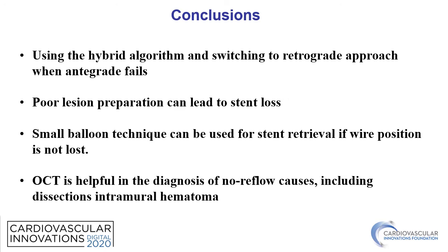Number two is that poor lesion preparation can lead to stent loss. In case of stent loss, if retrieval is decided, the small balloon technique can be very helpful if the guide wire position is still maintained, by inflating a small balloon distal to the stent and then retrieving both the stent and the balloon. Finally, in case of no reflow, intravascular imaging, and specifically OCT, can help diagnose the causes and guide treatment.